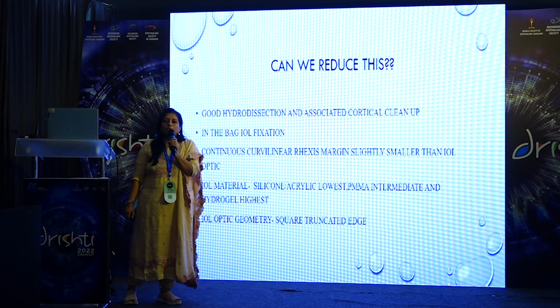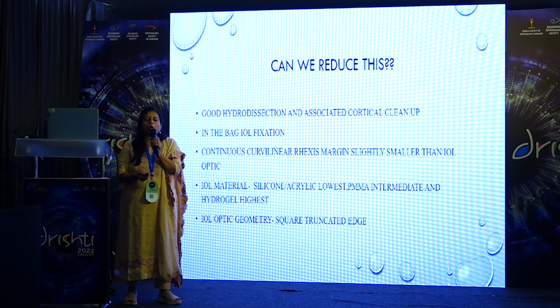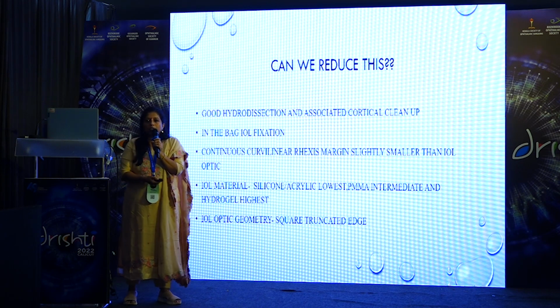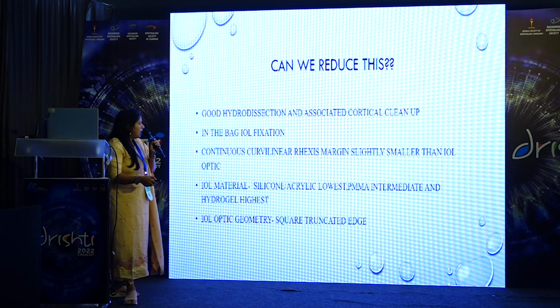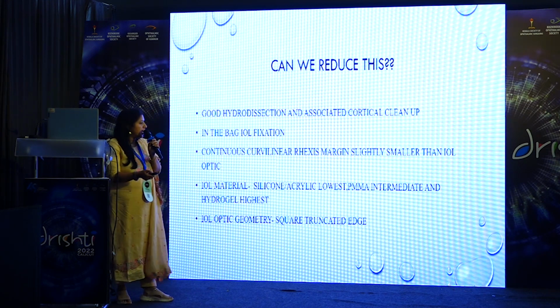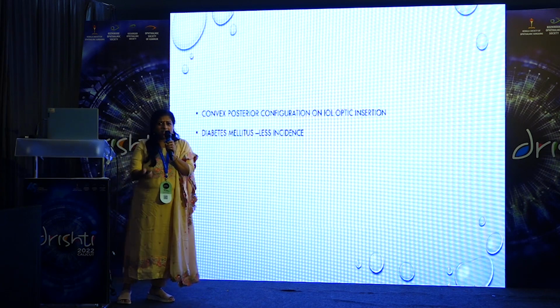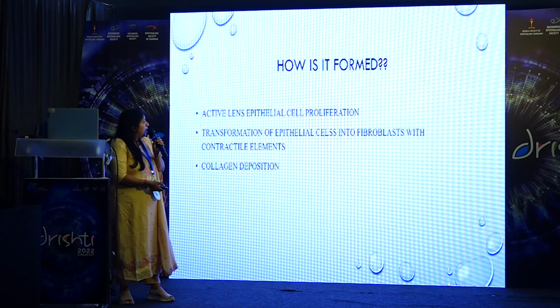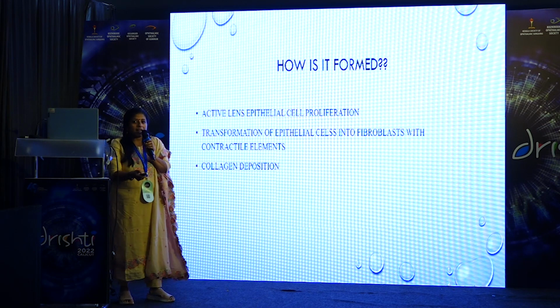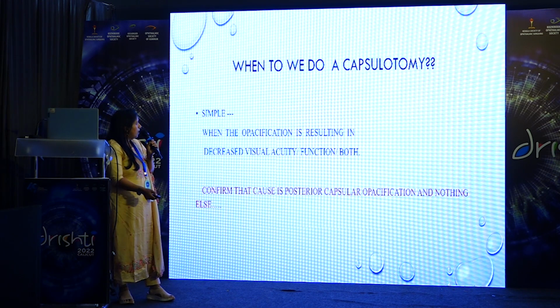There are different techniques. We all know how to reduce this. That is to ensure a thorough cortical wash, to put the IOL properly in the bag, to align the convexity of the IOL, then having a good rhexis margin, smaller than the IOL optic size, etc. Then the material of the IOL. Then the different appearances. These are all theory points which you all know.